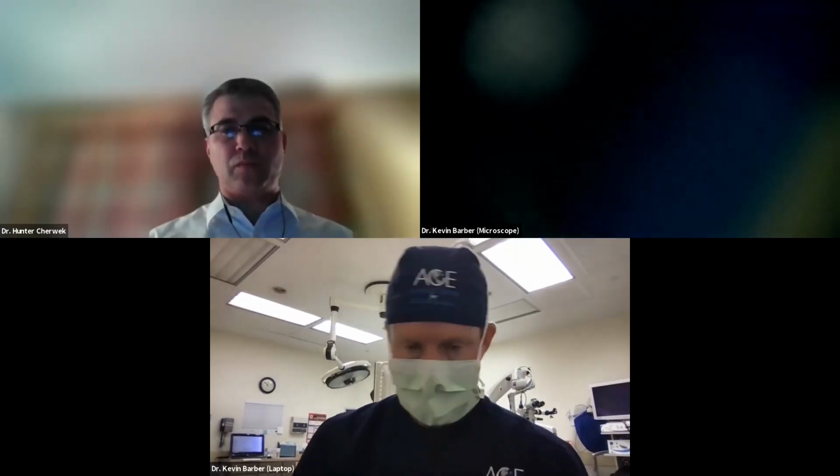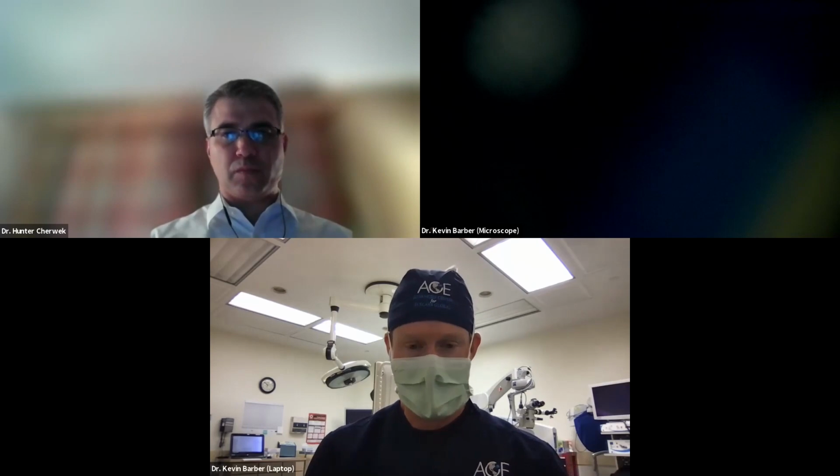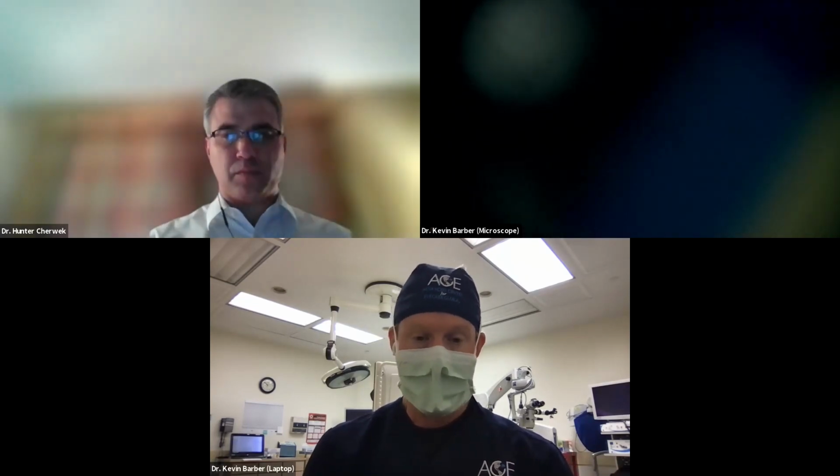I don't really have a definitive target that I can hit. I think that's a really important point. Sometimes we get really eager to use these toric lenses as we start to gain some confidence and momentum, and we end up putting them in patients that maybe we shouldn't, because we don't have the measurements that we need. I can't stress that enough.